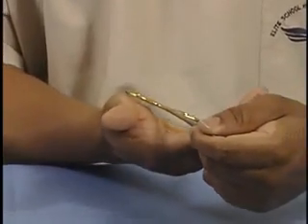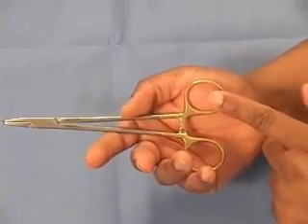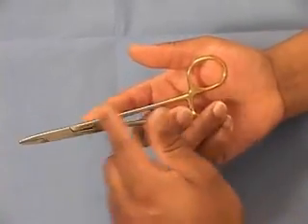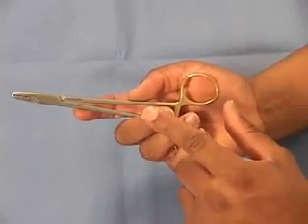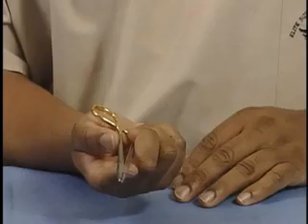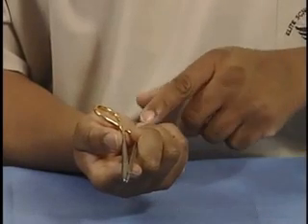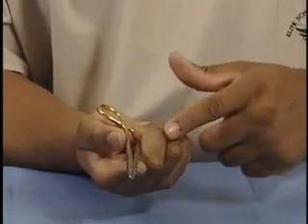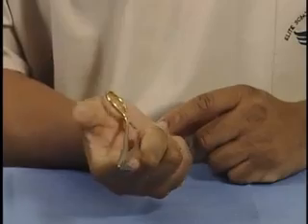Now let's look at the palming method to control the needle holder. The upper ring goes on the pad of the thumb. The index finger will again be applied to the shaft or body of the needle holder. The pinky, ring finger, and middle finger will be applied to the lower ring. To open and close the needle driver using this method, push towards the palm with the pinky, ring finger, and middle finger, and oppose that pressure with the pad of the thumb.